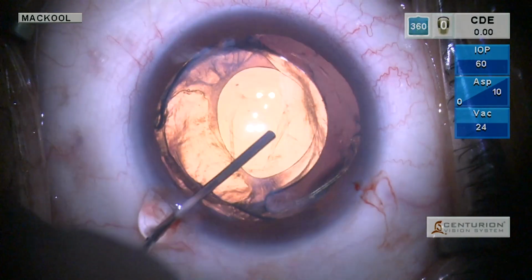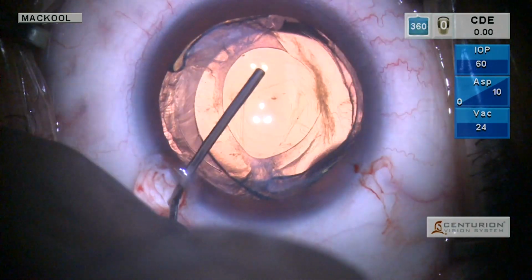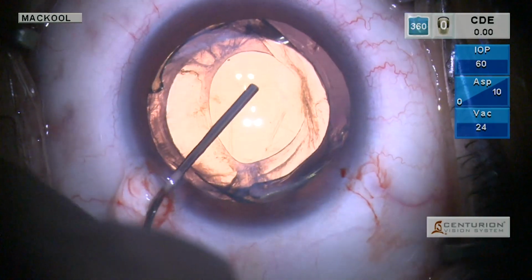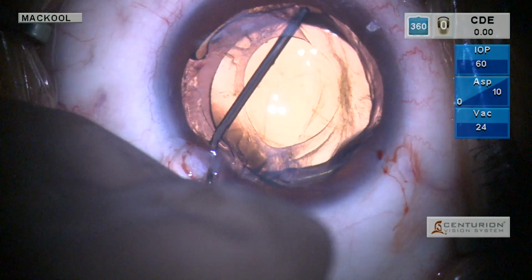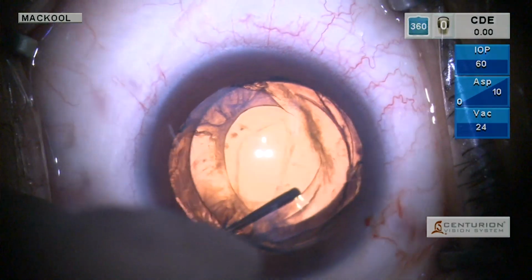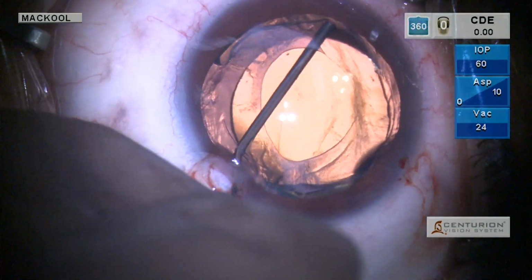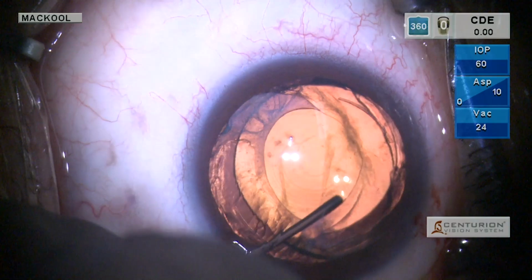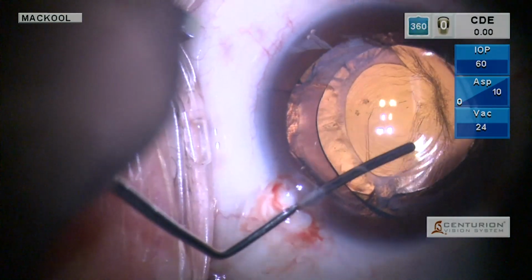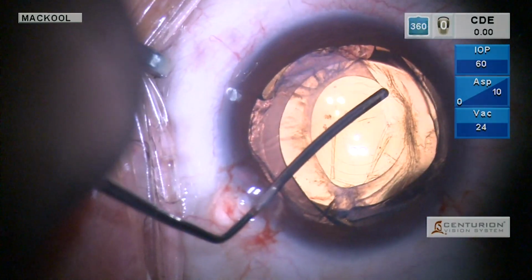And yep, we can even rotate the intraocular lens already. So without enlarging that posterior capsule opening, we've accomplished visco-dissection. And now rotate it to uncrimp that haptic a bit and keep the IOL centered. And let me just test to make sure where the best centration is. Looks like it's right around there.